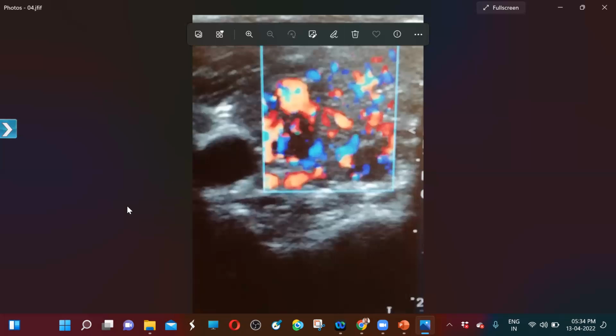For me, it doesn't look like Graves' disease, because in Graves' disease, I will see almost no tissue when I am putting color. I will say only color and color only. Believe me, if you see the thyroid inferno once, that will get pasted into your mind once and for all. So, doctor, this case has been sent to us by the same doctor, Dr. Rajesh Das.